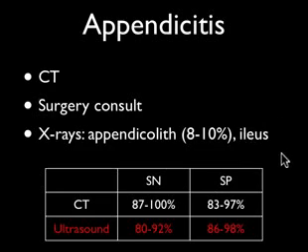So we get a surgery consult in a lot of these patients, and the first thing the surgeons, well, historically, have turned to has been CT scans. Lately, though, I've noticed that especially our surgeons at UCI are getting very good about using CT as a last resort, and that's been very reassuring to me. But you can see why they've historically turned to CT scans. The sensitivity for CT, with the new multi-detector CT scans, is up around 96%, 98%. It's very, very good. Now with ultrasound, the sensitivity depends.